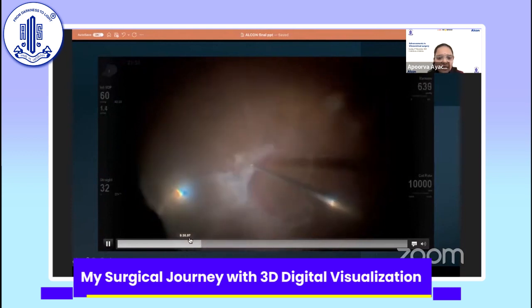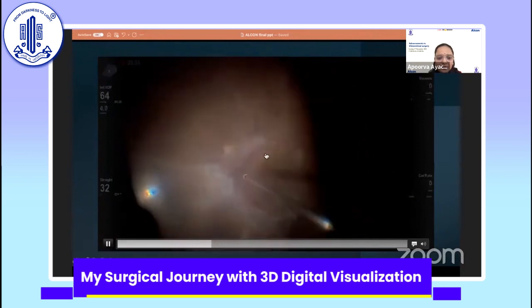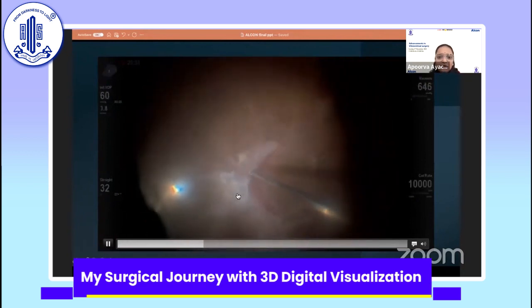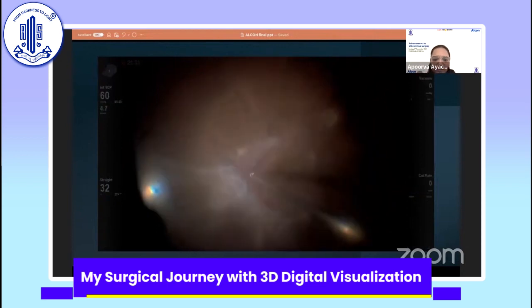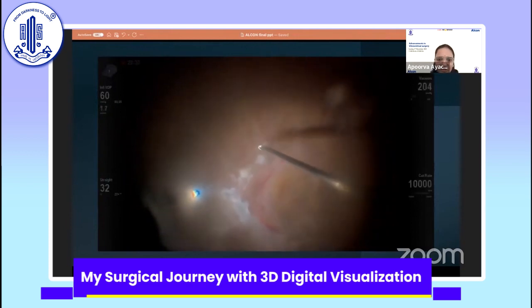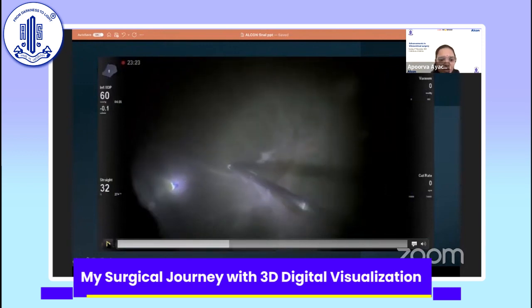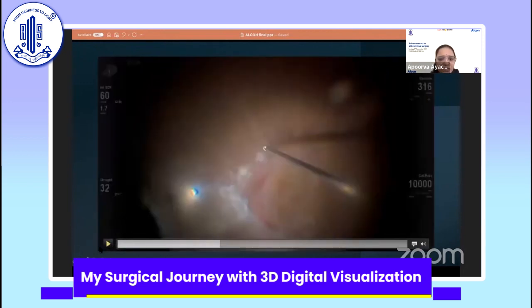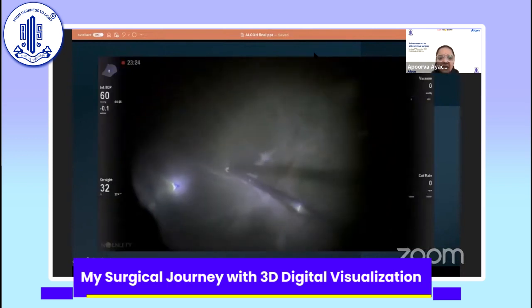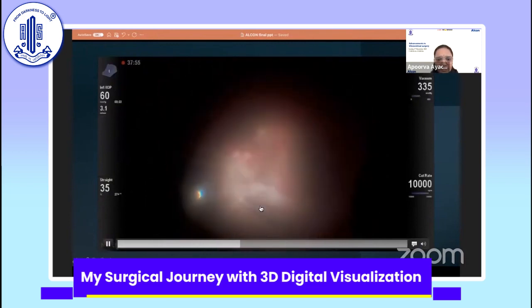You can see that till now I have not used any forceps. I'm able to get a plane. I believe that the head of the cutter keeps the retina below it down for us, and the mouth of the cutter attacks the membrane that is above it, of course, after we get a good cleavage. So now, by conformal delamination, I'm able to get away all the membranes. And now I change the filter. When I use this green filter, I'm able to see much better these superficial membranes.